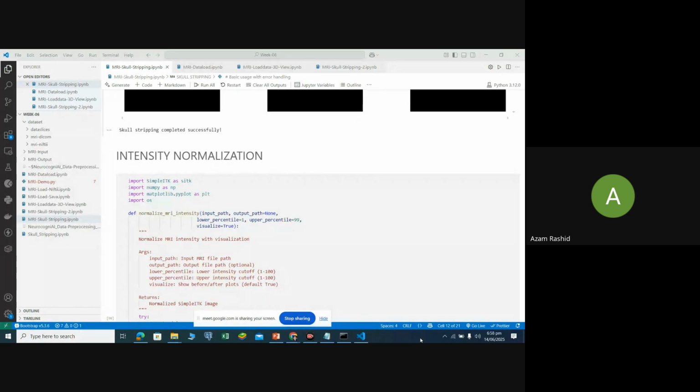These are the things for the doctor in the pre-processing of the MRI, plus some explainable AI. When we apply Grad-CAM and other methods, they also open the black box of the prediction.